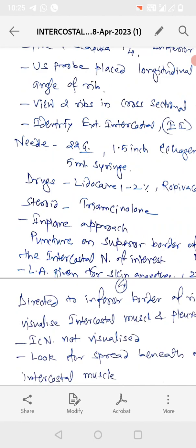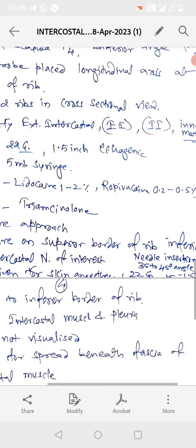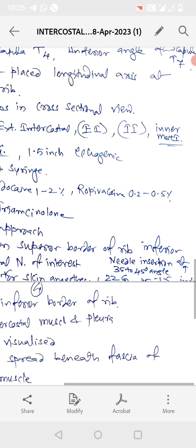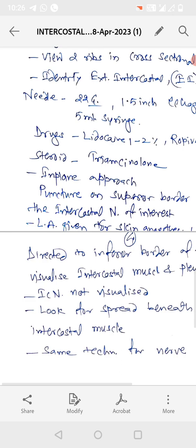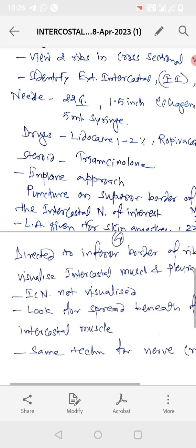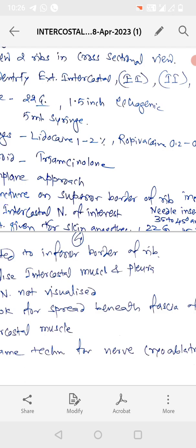Now we should identify external intercostal muscle, internal intercostal muscle and innermost intercostal muscle. Needle selection. Needle is 22 gauge, 1.5 inch echogenic needles are preferred and 5 ml syringe is taken.